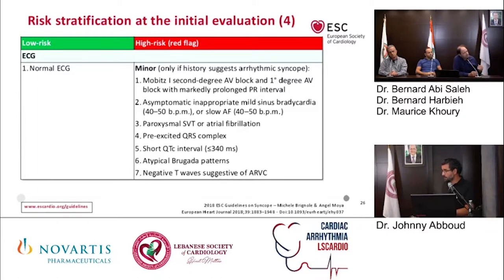I'm sorry, I'm stuck on this same issue. Negative T waves up to V3 in females are considered one of the normal features, so we pay attention to this. It's tricky sometimes, especially if you have a pattern of right bundle branch block that can explain the negative T wave. So it's not always easy to differentiate. But if it's a slight T wave inversion, it's one thing, and if it's a deep T wave, it's another thing. So it depends on the morphology of the EKG. And sometimes it's borderline. You can have all these with a normal EKG also. When you see T wave inversion in females, it's usually most common above the age of 40, and these groups are usually younger. And as you said, the deeper T would make more sense. Yeah, exactly.